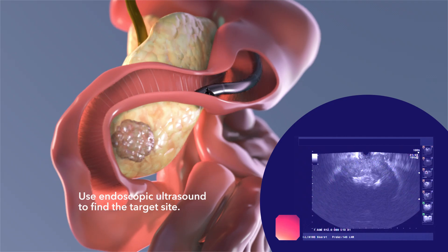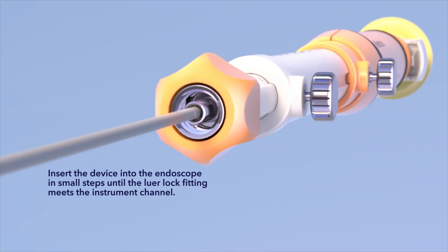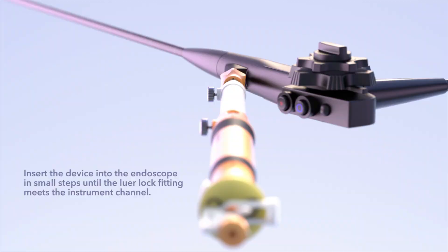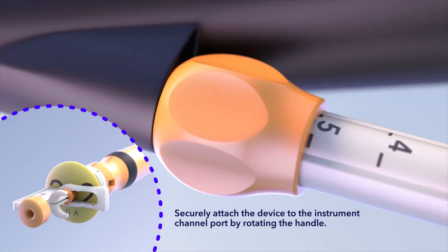Use endoscopic ultrasound to find the target site. Insert the device into the endoscope in small steps until the luer lock fitting meets the instrument channel. Securely attach the device to the instrument channel port by rotating the handle.